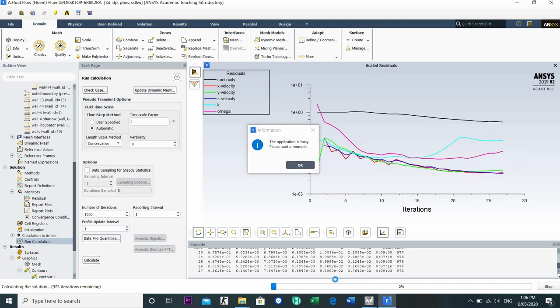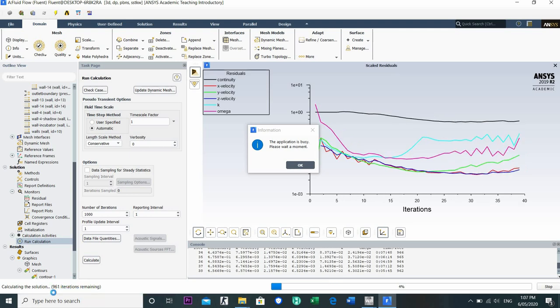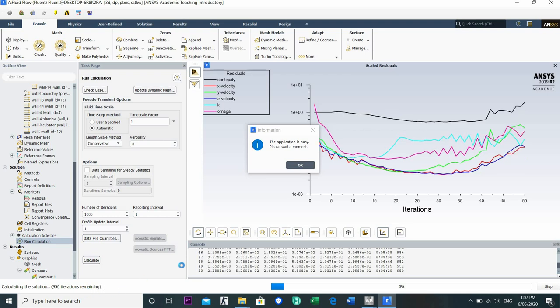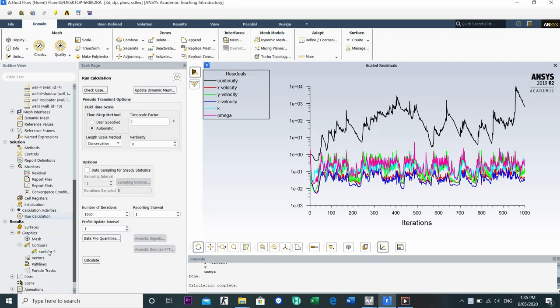Okay, we just need to wait for the remaining 950 iterations. Okay guys, after that you can click OK in the tick box. I actually already checked it, I mean clicked it at complete and done. It's already done.